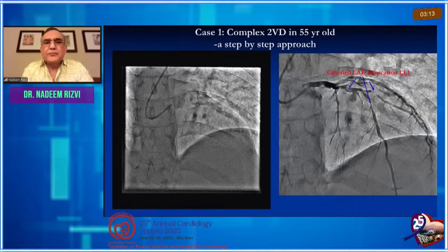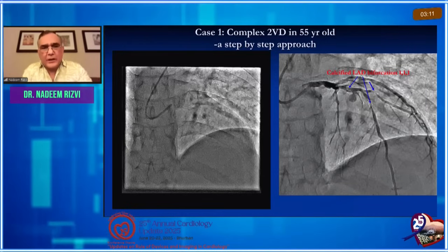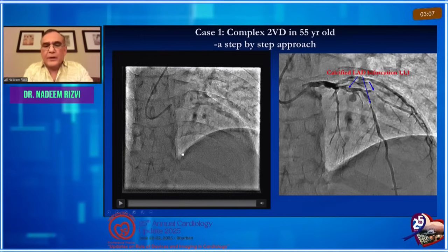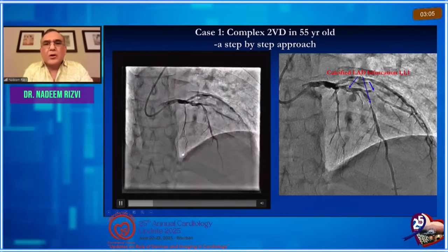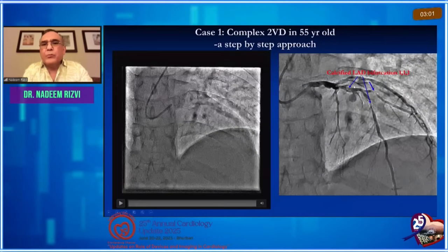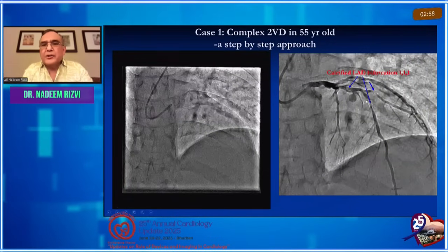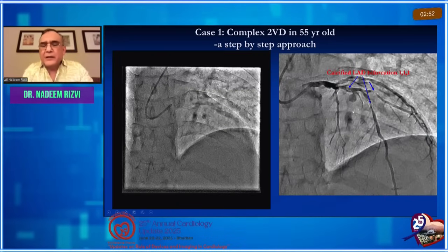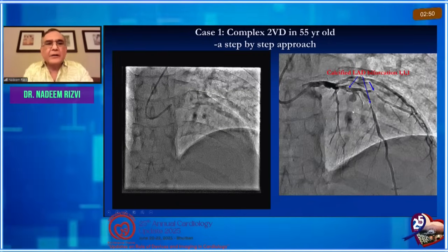All right, so the first case example is basically to tell you about the inventory. Now, as you can see, this has a distal left main. I'll just go back. And so this is a calcified lesion. It's got calcification. This is again from the local perspective. In the US, they probably would rota it, etc. But here, this is a calcified left main, a real life case.